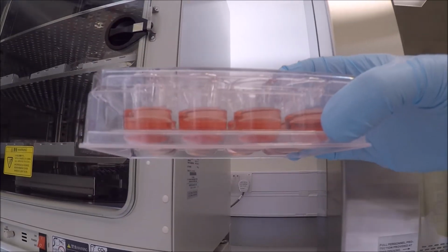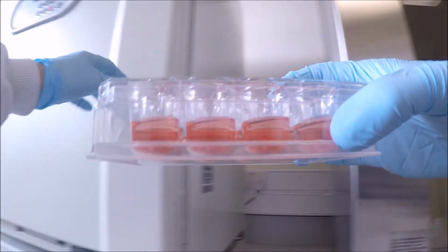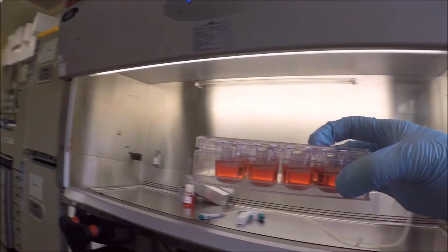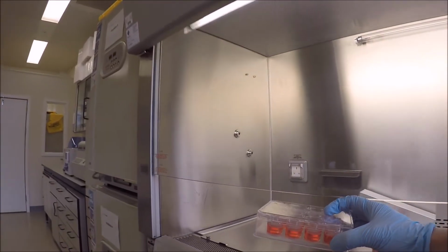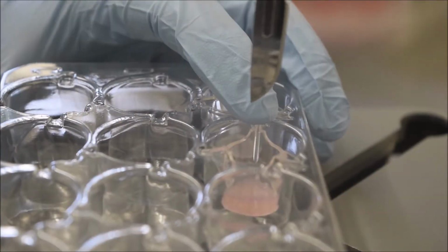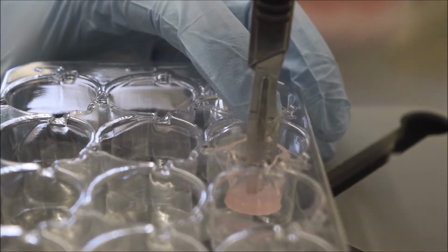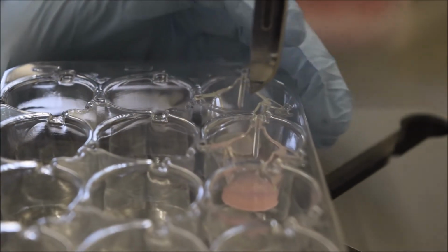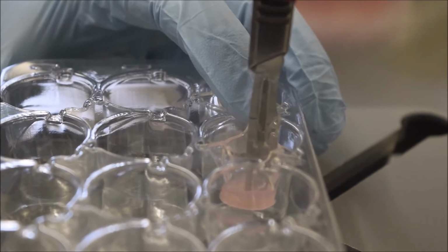Better diagnosis and wound management may prevent chronic wound formation. Therefore, a new tool to help identify changes in the wound healing process may prevent this from occurring. This is where wounded artificially made skin models like Labskin produced by Integument may really help assess the wound healing process and identify the molecular differences between normal and chronic wounds.